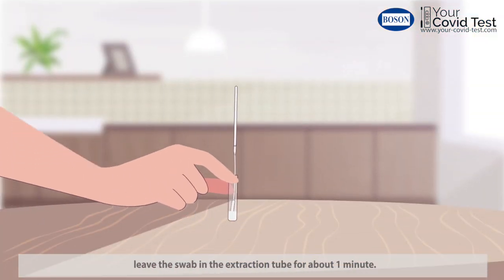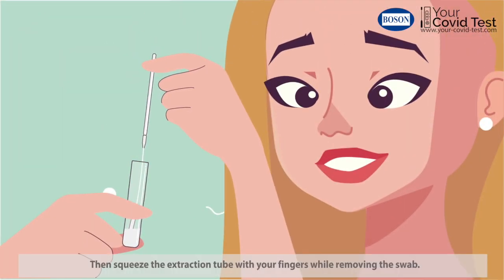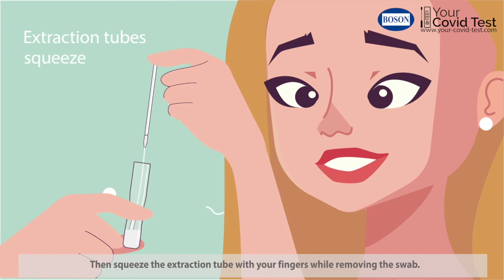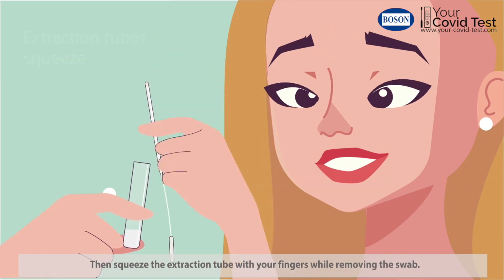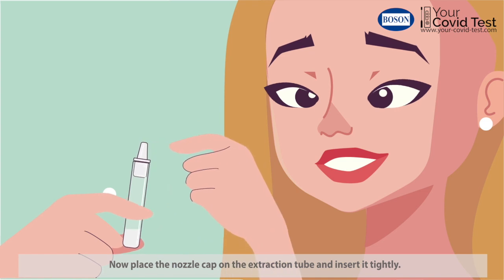Then leave the swab in the extraction tube for about one minute. Then squeeze the extraction tube with your fingers while removing the swab. Now place the nozzle cap on the extraction tube and insert it tightly.